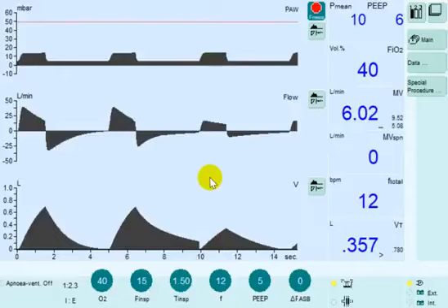However, with increased resistance, take a look at the expiratory phase and you will see limitation of the flow. You can see the peak expiratory flow is decreased compared to the previous breath, and it takes longer to exhale all the way to the zero line.